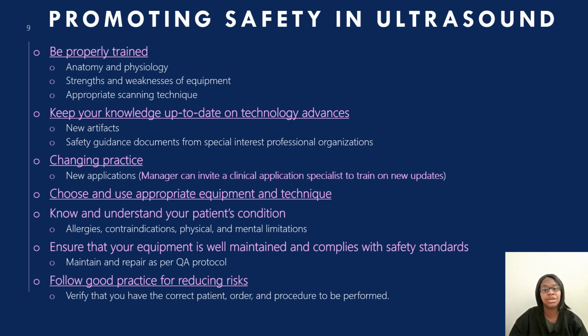Know and understand your patient's allergies, contraindications, physical and mental limitations. For breast ultrasound, we have to get the patients to bring their arm up. So if I'm scanning their right breast, their arm has to go up above their head. Sometimes the scan is for 5 minutes, 10 minutes, 30 minutes. So you just never know.